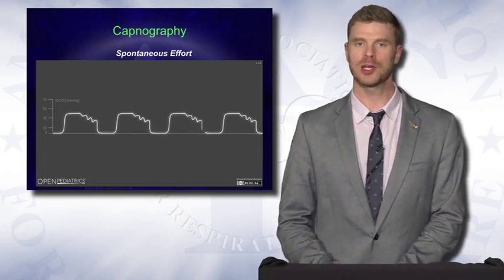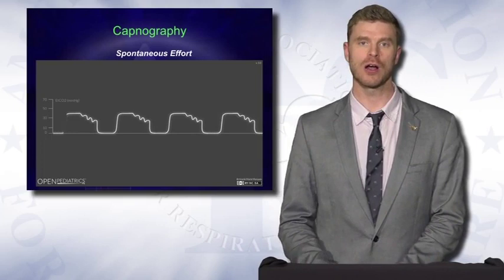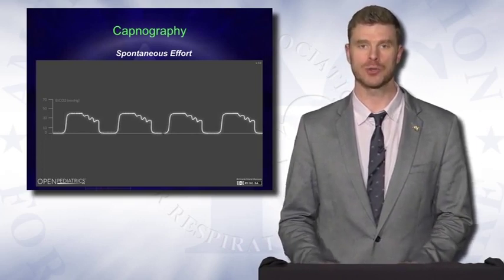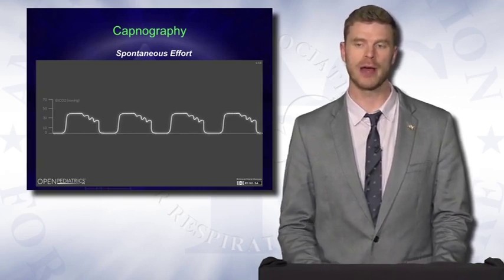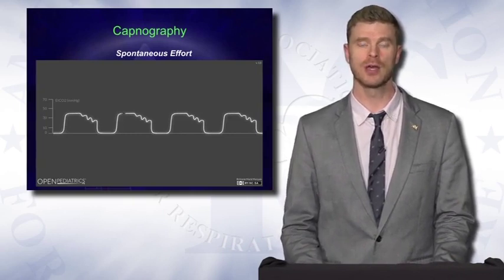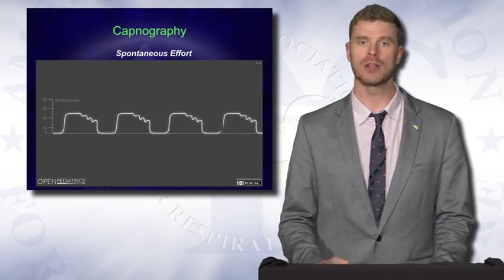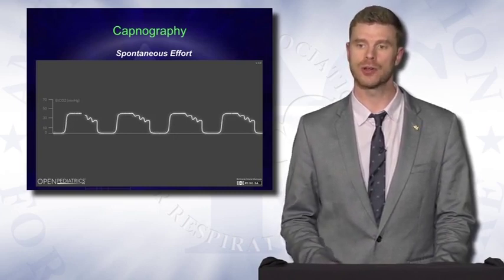It's probably my favorite because it's really not that big of a deal most of the time. Most patients who you'll notice this in are cardiac patients in which their intrathoracic heart is able to cause flow oscillations and therefore disturb the CO2 pattern. You may also notice it in patients who have excessively long expiratory times, during which the actual expiratory flow is fairly low, meaning that the heart is able to oscillate and generate some flow within the circuit.